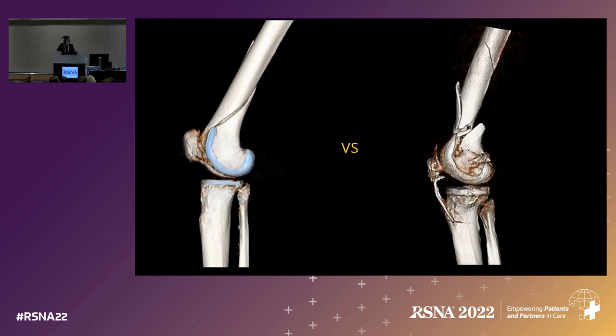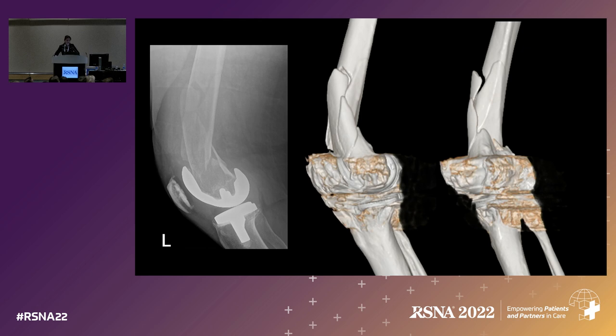Okay, so this is really what you're telling them, right? Displaced and comminuted or not, and how much of it is involving the part around the arthroplasty itself. So we're going to practice this real quick.